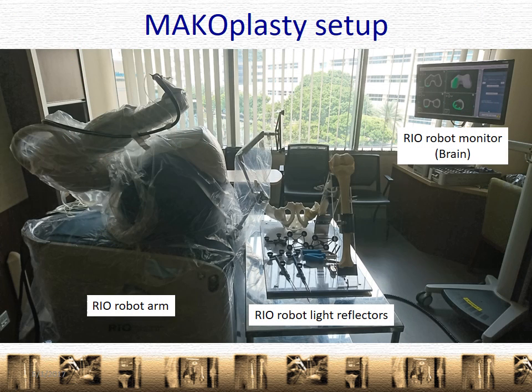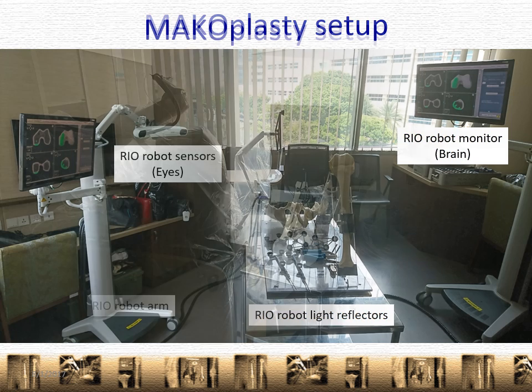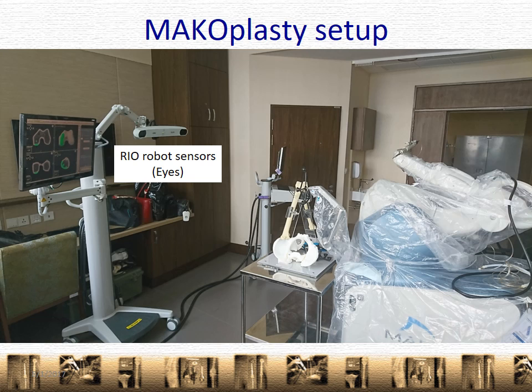This is the Makoplasty setup. In the bottom left-hand corner, you'll see the real robot arm, which is the business end of the machine. These little bits here are the light reflectors — I'll show you how that works in a while. And this is the monitor, which I like to think of as the brain. And over here is the robot's sensors, which are the eyes.